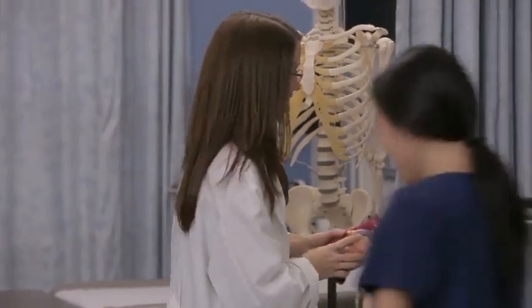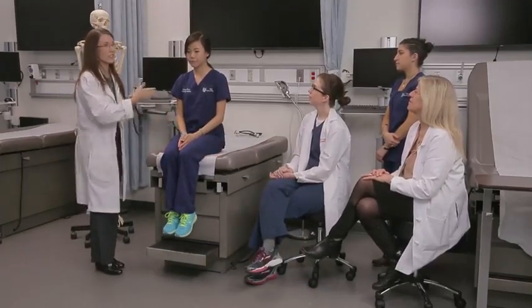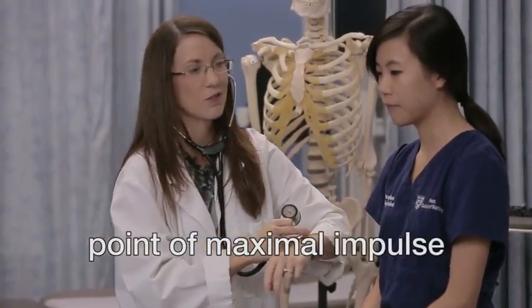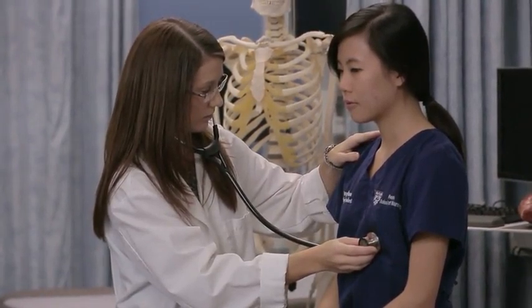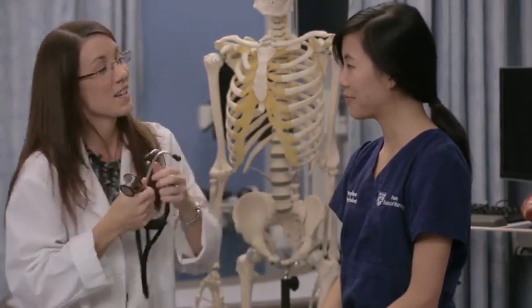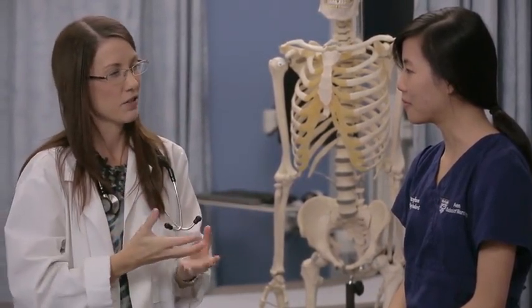Could you demonstrate on one of the students? I'm going to listen at the point of maximal impulse — that spot between the fifth and sixth ribs. It sounds like your heart rate is just about 75 beats per minute. When I'm listening, I'm also able to hear the basic heart sounds: S1 and S2. S1 is when the AV valves close, and S2 is when the semilunar valves close.